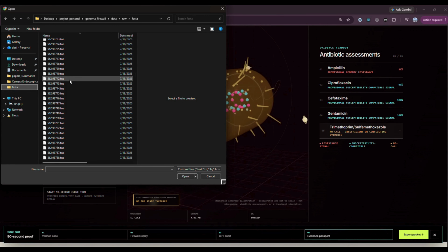Firewall replay exposes the immutable decision path. Statistical association, known biological markers, target evidence, and safety checks remain separate. The interface shows calibrated probability, conformal set, marker evidence, target status, distribution shift score, and the guarded output. A confident prediction can still be blocked when the sample is out of distribution. The scientific outcome is locked before any optional language model audit.